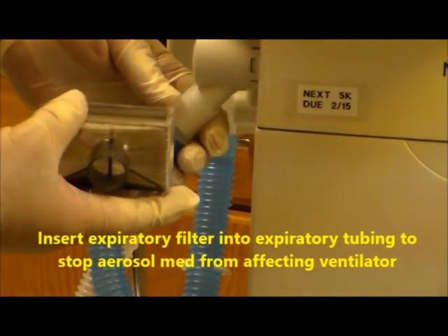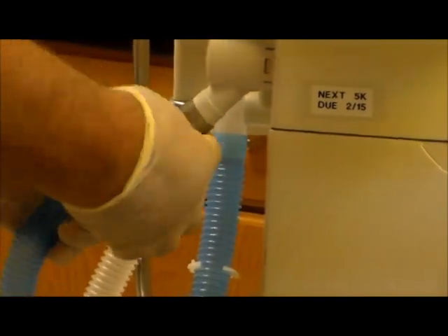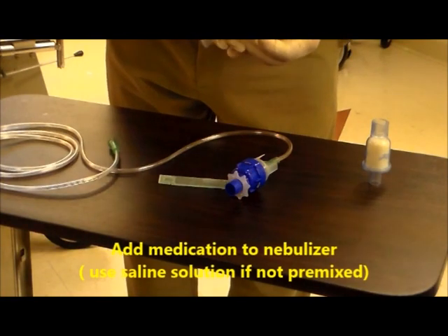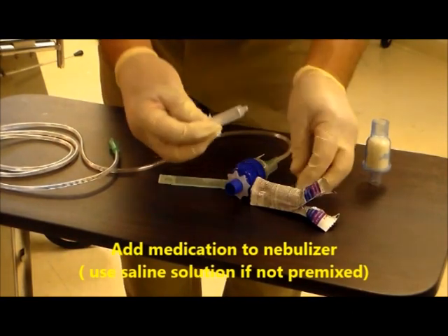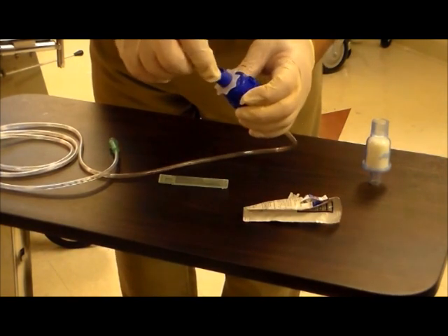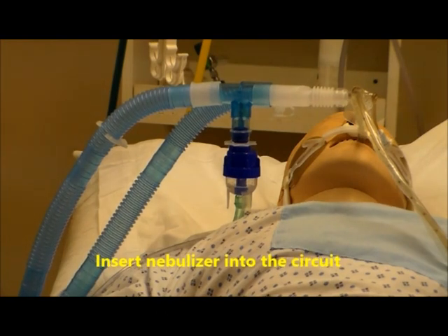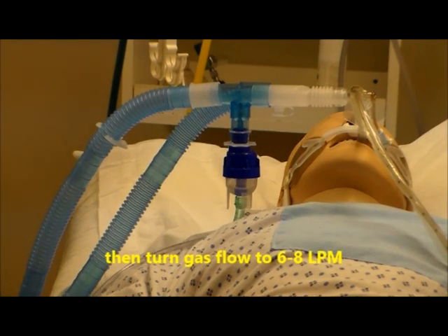Next you want to put the expiratory filter on the expiratory side of the ventilator to prevent the medication from getting back into the ventilator. Then aseptically put the medication into your nebulizer. Next, put the nebulizer in line and turn the flow to 6 to 8 liters. Remember, for this particular type of nebulizer, make sure you have that little white adapter in there.